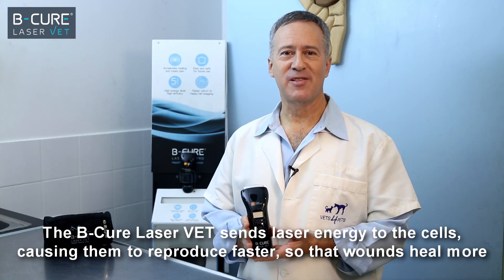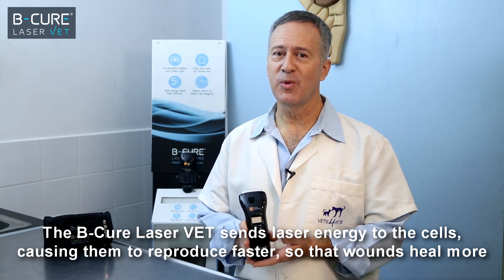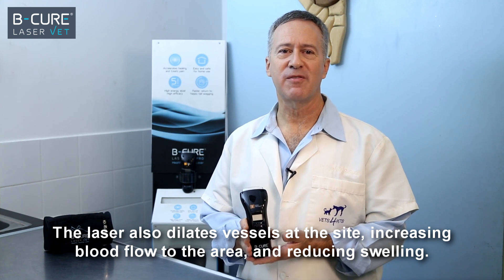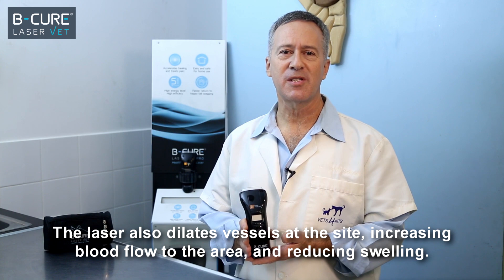The BeCure LaserVet sends laser energy to the cells, causing them to reproduce faster, so that wounds heal more quickly and with less pain. The laser also dilates vessels at the site, increasing blood flow to the area, and reducing swelling.